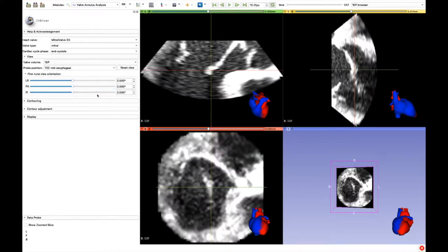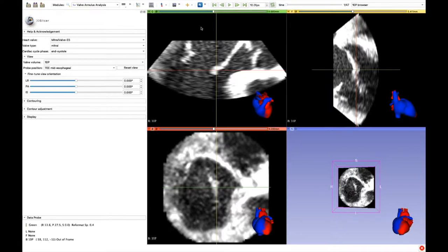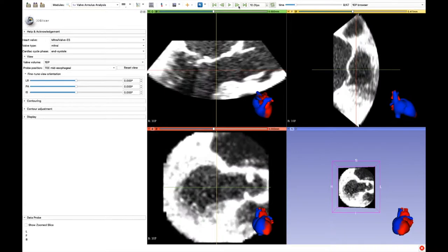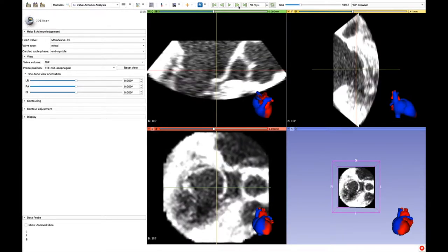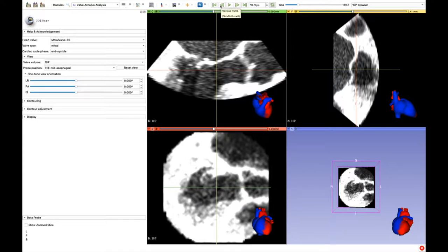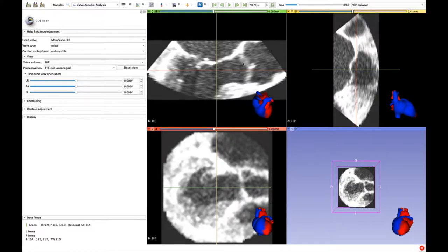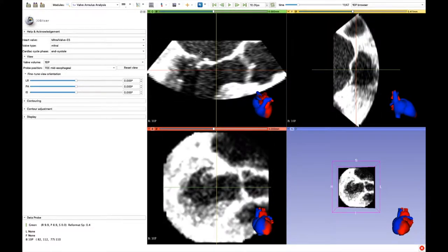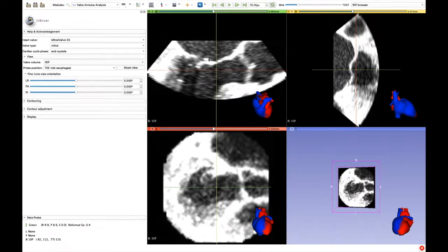As you can notice in the top left panel the mitral valve is open. Therefore we should look for the end-systolic frame, which by definition is the frame just before the mitral valve opening. It is possible to regulate contrast and brightness for the image by clicking on the panel and while holding, moving left and right and up and down respectively.